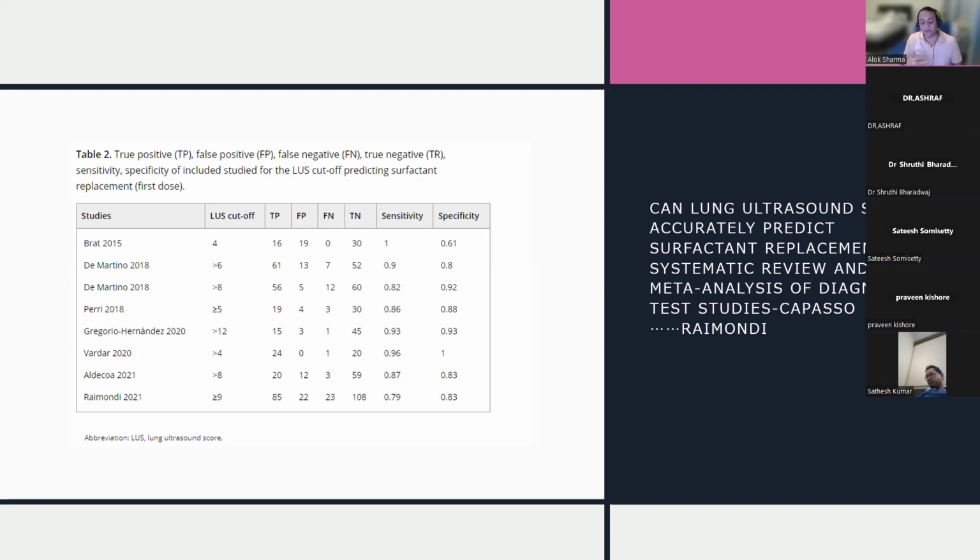Level threes will have a spectrum of babies between 22 and up to 37 weeks. And in level one, a near-term or term baby, for reasons such as diabetes in the mother, may actually have respiratory distress syndrome. So how do you implement a lung ultrasound and lung scoring protocol to satisfy this spectrum?